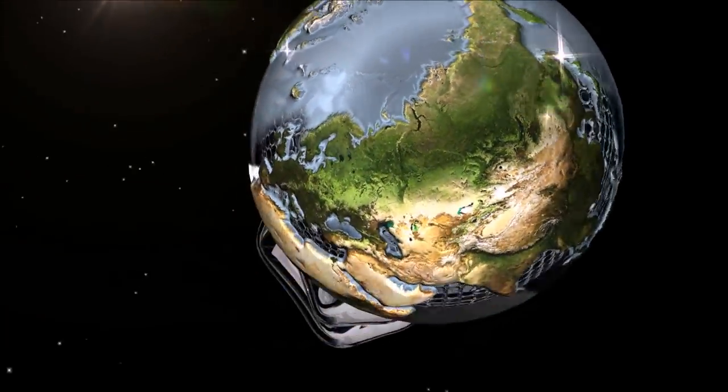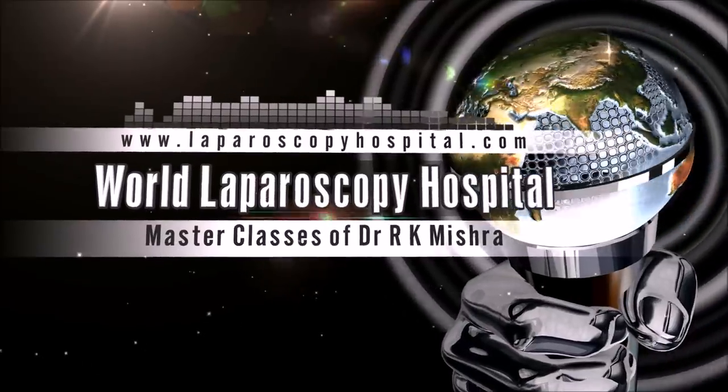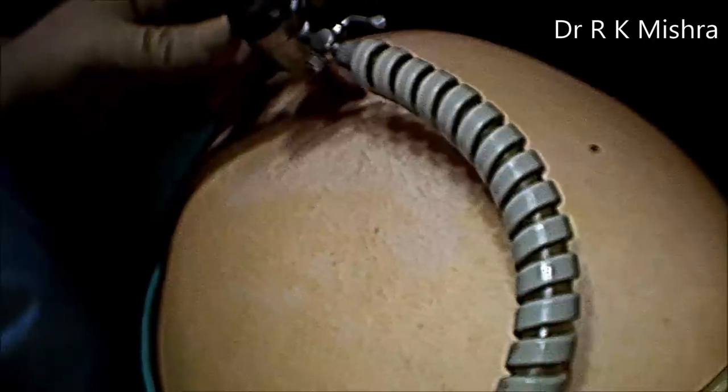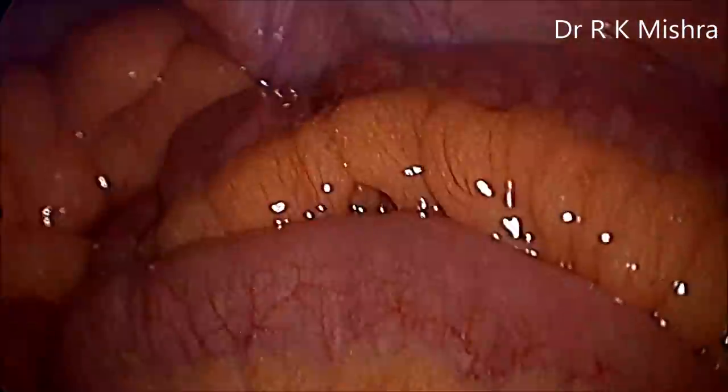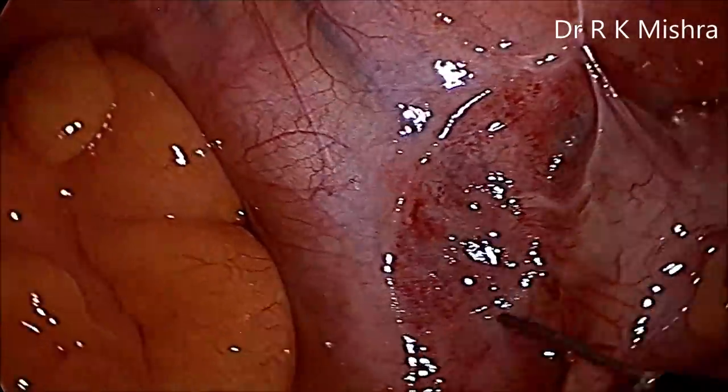Hello friends, this is a case of acute appendicitis with lump formation and phlegmon formation. Here we have entered inside with the umbilicus. After going inside, we can see the right iliac fossa, and here there is a lot of inflammation.